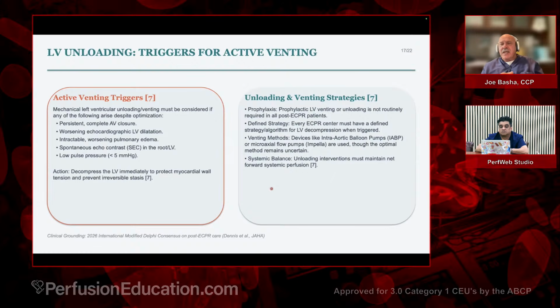And we see that a lot, where we're putting Impella in first and it's failing, because the right heart's going to fail, and then we're going to either go to bipella, RP and systemic, or we're going to go to ECMO. I think sometimes they are over-aggressive with their device being the panacea, the one-size-fits-all, and it just isn't. So I like them as far as I think the device has utility. I think it's overused and sometimes misused because their salespeople or their clinical reps are just too terribly aggressive.